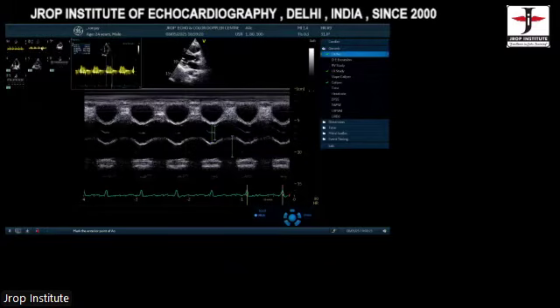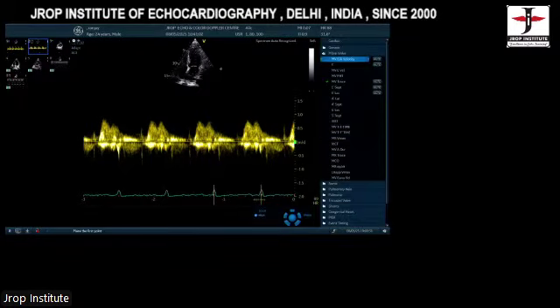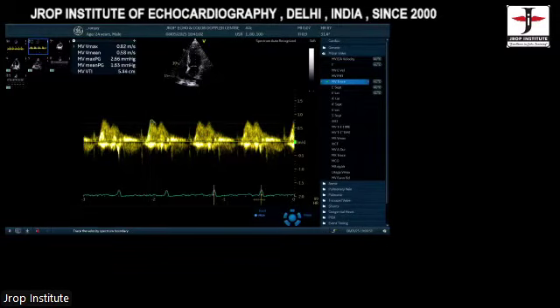Look at the screen. This is what the Doppler flow pattern is. Correct? This is a Doppler flow pattern across the mitral valve. So I'll go to the mitral valve trace. Now take this Doppler spectrum pattern. Start with the beginning of this Doppler spectrum pattern. Go up. Come back. Go up. Come back. Now you get a correct heart rate. So once you trace this Doppler spectrum pattern, you will automatically get peak and mean velocity gradients and velocity time integral.